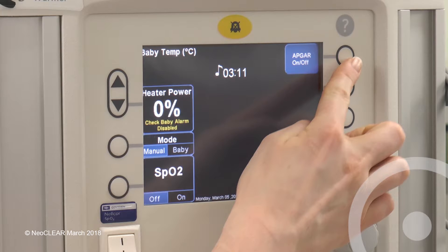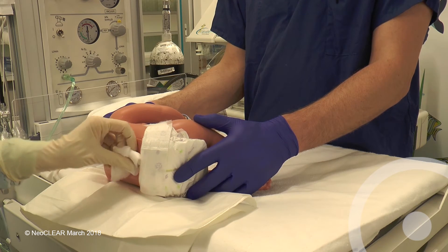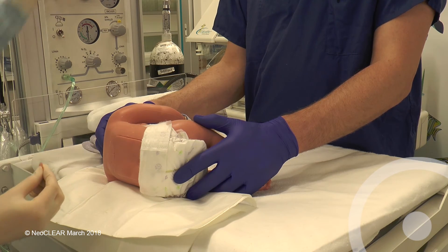Note the time of the end of the procedure once the needle is withdrawn if the first attempt has been successful, or continue timing until the end of the second attempt if required. Ensure no CSF or blood is leaking and apply a spot plaster or spray-on dressing.